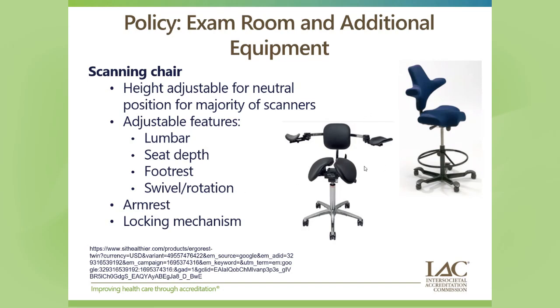The seat depth will also help contribute to your back support. Just looking at some of these examples here, sometimes with the more complex scan chairs, the seat itself will slide forward and back in addition to up and down. For certain individuals, that change could make the world of difference for their comfort for the exam.